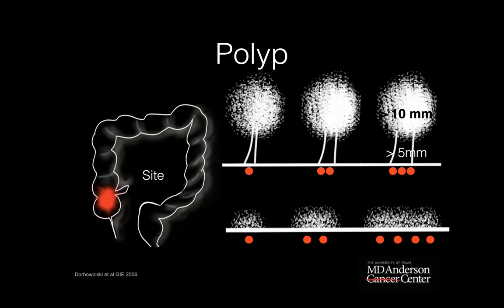So as a fellow, if you want to cut a large polyp and you want to play safe in the initial part of your practice when you go out, probably not a bad idea to take a smaller snare. Start with a 10 millimeter snare. You may end up cutting a little more number of segments of polyp, but you will come out safely. So something to keep in mind.